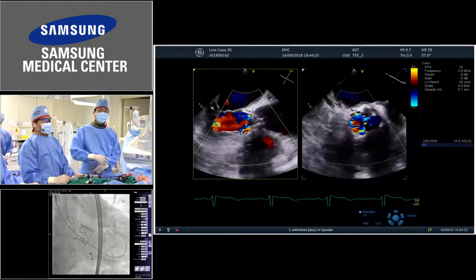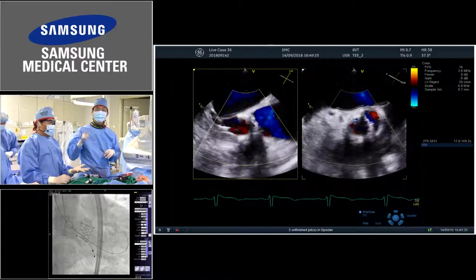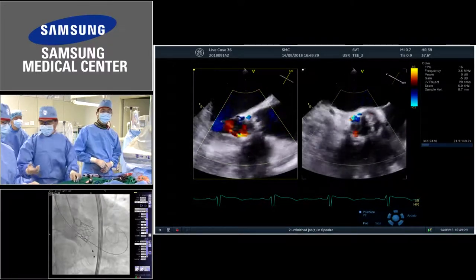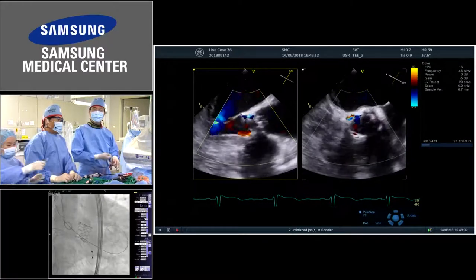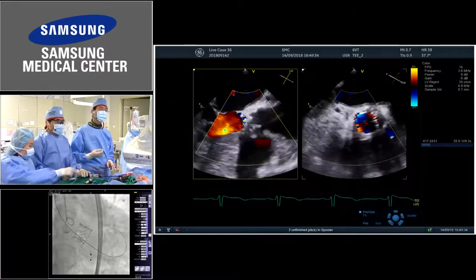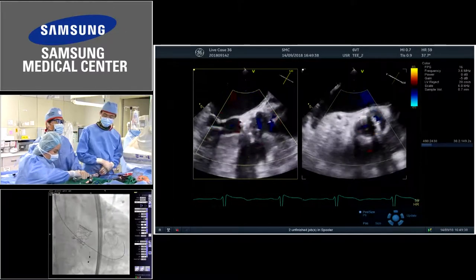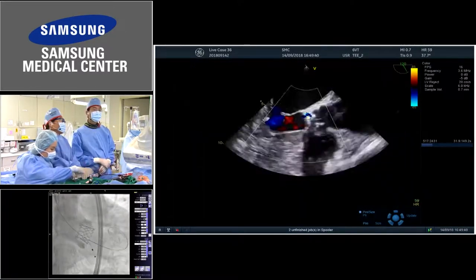But beautiful. In this case, a stent was inserted rather than a balloon. So all I have to do when the coronary artery is occluded is pull out the stent. That is easier, but not quite, because you have to take care. Oh, I'm sorry, Eric. Go ahead.